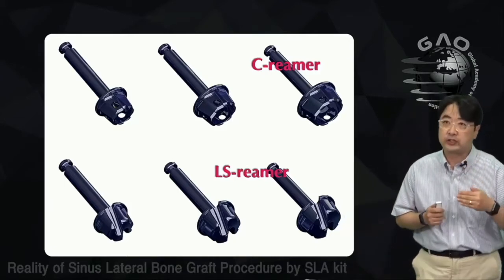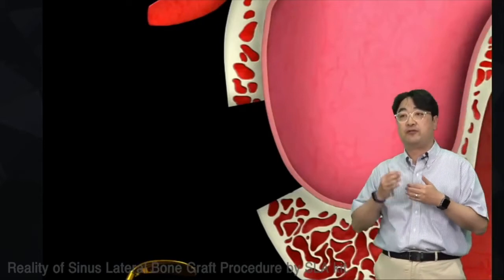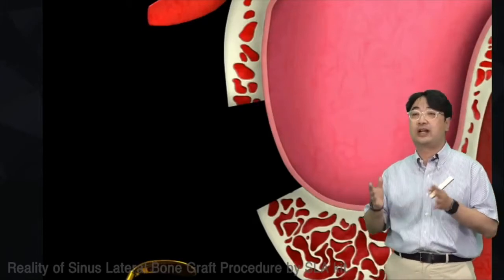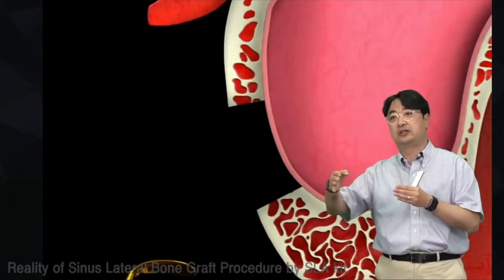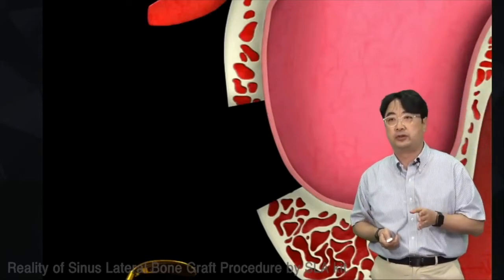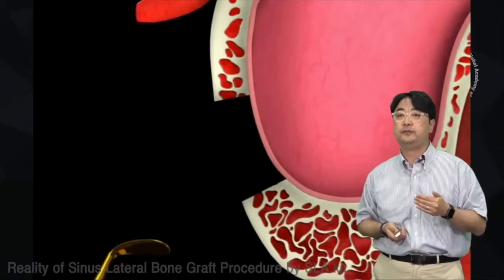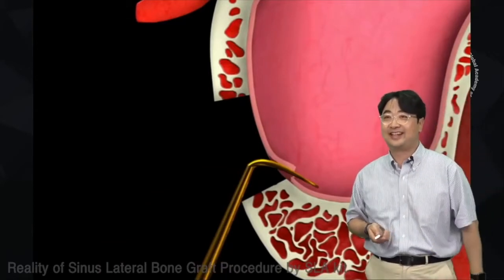For sinus graft, you must do membrane dissection using the freer elevator. 'Freer' means you make the membrane free — it acts differently from a curette. With a curette you dig out with a pulling action, but with the freer you push out. When pushing, the tip of the instrument must always touch the bone wall. If not, you may cause tearing during dissection.